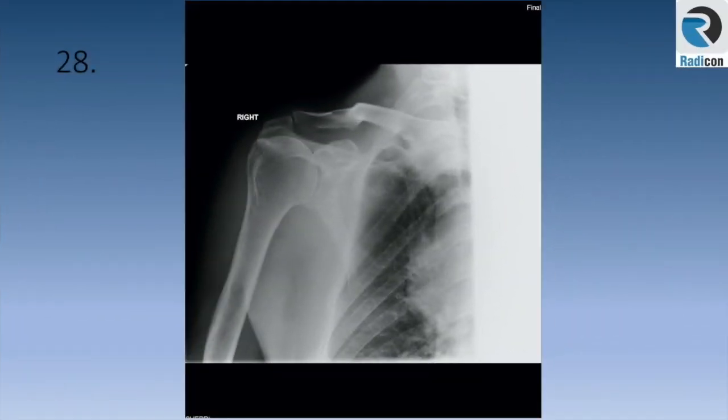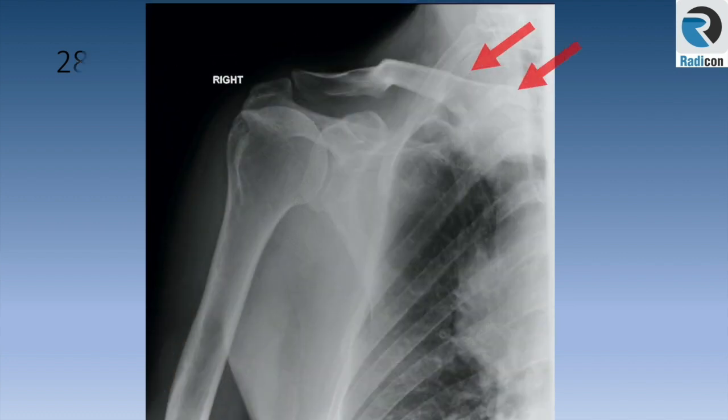Case 28. Right shoulder view. While you are looking for the obvious and occult abnormalities, please pay some attention to extra findings. A classic rapid reporting film is where an unexpected finding is present — such as this shoulder X-ray showing a right lung apical tumour.